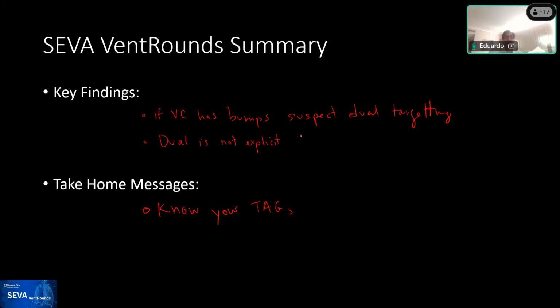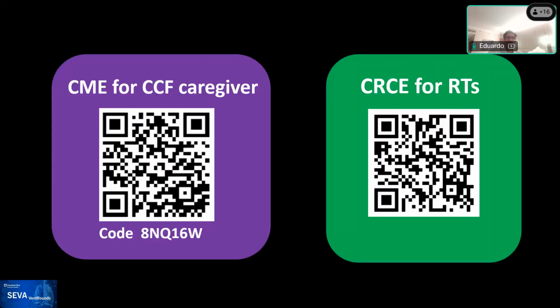I love that. And it's not an explicit thing. So it's not like you're going to grab the manual and it's going to say, oh, this is dual targeting. They will use other words to explain what the mode does. In some manuals, it explains it rather well, but it uses words that perhaps are ambiguous to the clinician. For example, the term flow adaptation, very romantic, but it's not telling you that it's changing from volume to pressure, and it does tell you that the patient may receive larger tidal volume than what you are aiming for. So key important points for you to be aware of.